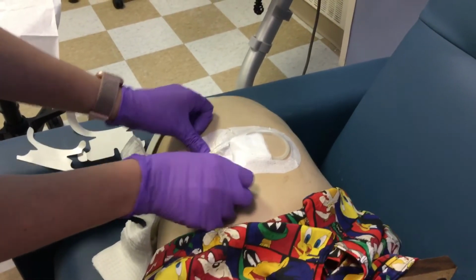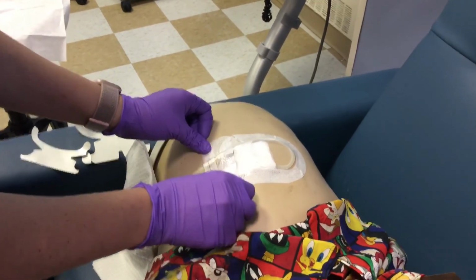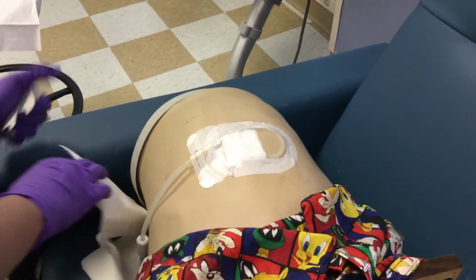Once complete, you will document in Epic the dressing change and the site assessment, and you are complete.